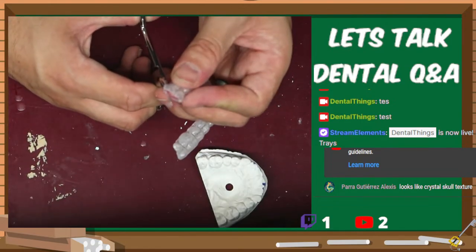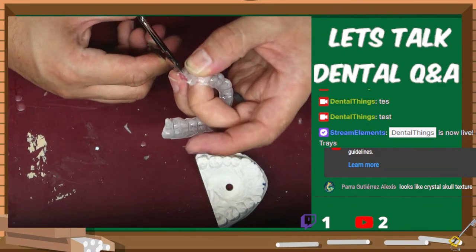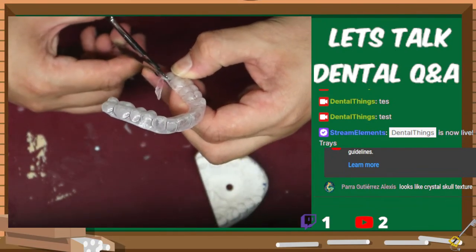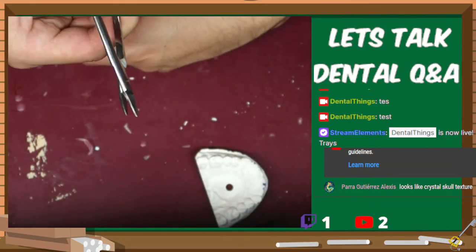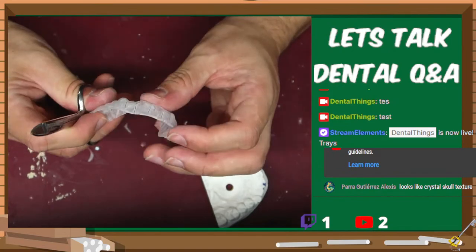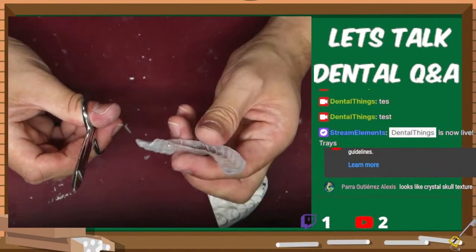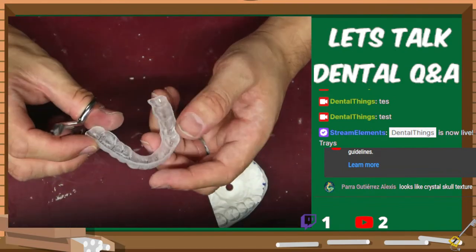good fit. And on these last teeth, you don't really need to come across. You can kind of fit the tooth to the best of your ability to make sure it doesn't feel weird. And now that I got that little piece off, we can go and inspect the other areas. Right now, it doesn't look too bad. It's a little frosty, not that see-through. It's really cloudy. So I'll clean that up here in a second.